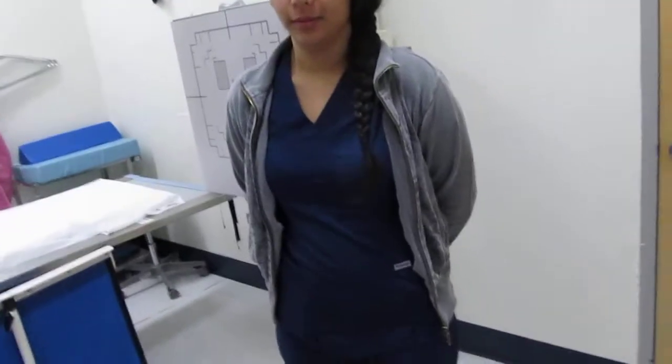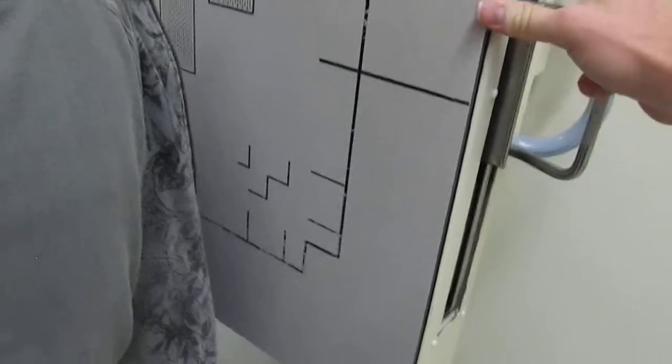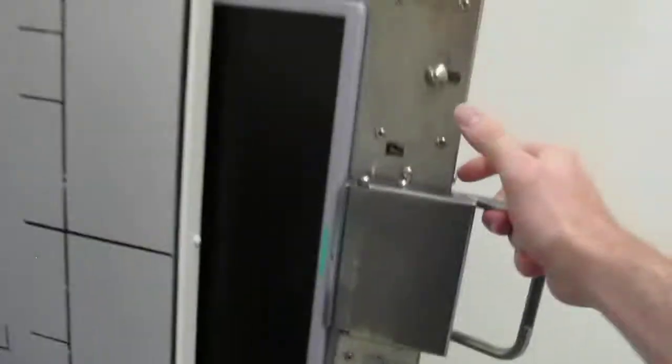Jane, is there any chance that you are pregnant? No. No chance? Okay. Today we're going to do a chest x-ray. We're going to do 2 different x-rays. For this first one, I'm going to ask for you to stand with your chest against the board, facing the board. Okay, so I'm going to move the shield. It's important to shield. And we have the x-ray cassette already.